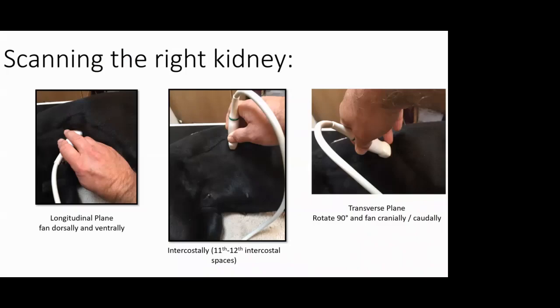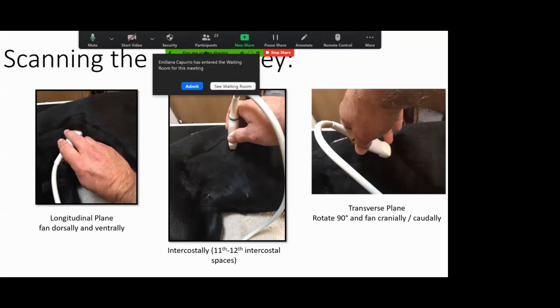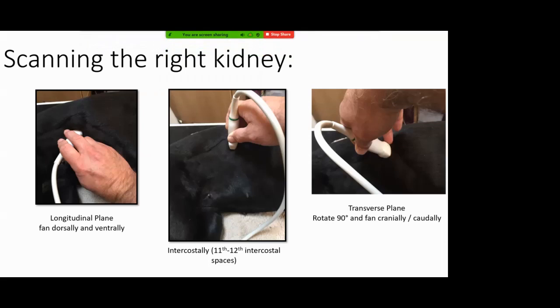For the right kidney, with the dog in left lateral recumbency, the starting point for the longitudinal plane requires tucking right up under the ribs — it can be a tight squeeze. Once you've got the longitudinal view, rotate 90 degrees and fan cranially and caudally as on the left side. In the longitudinal plane you fan dorsally and ventrally. If you really struggle to access the kidney, consider looking through the intercostal spaces — usually the 11th to 12th intercostal spaces.